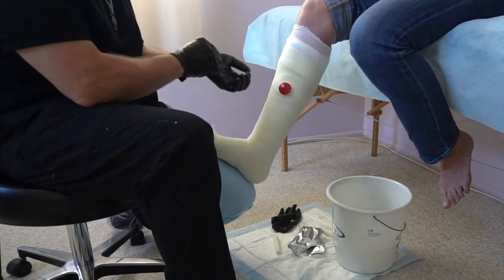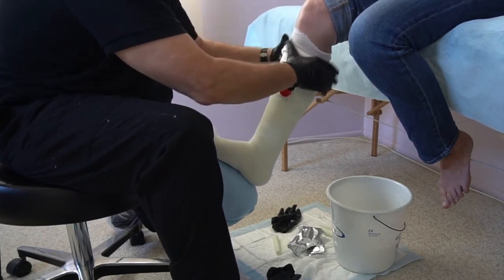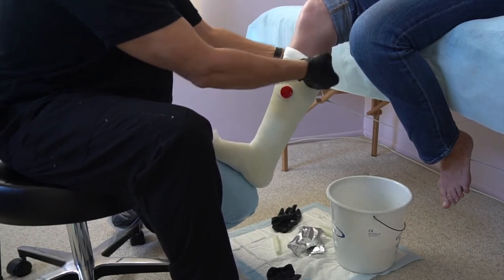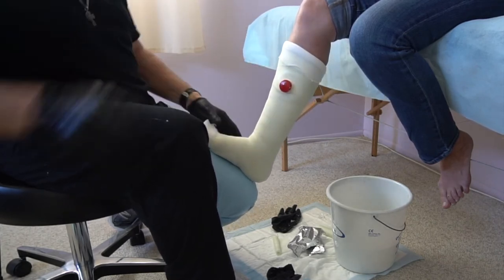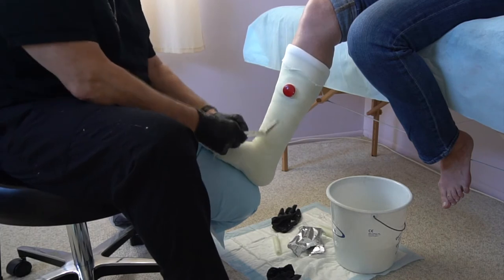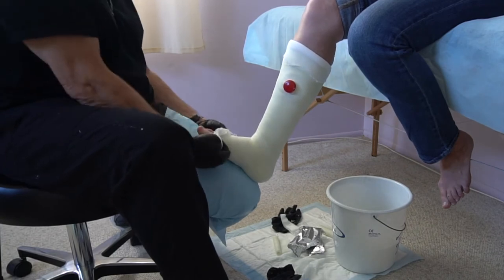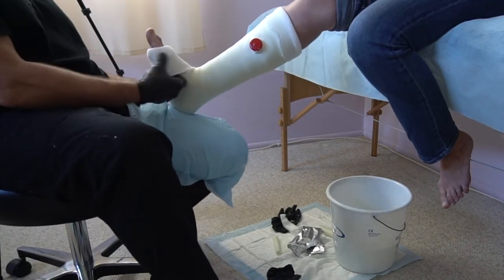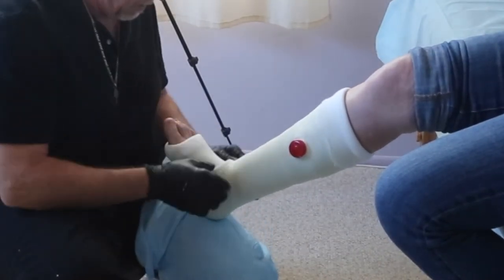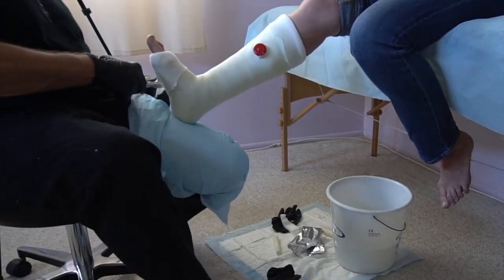Get rid of the first wet sticky set of gloves and fold that cotton over. If you need a little more, go ahead and add another layer of cotton. And we'll peel that back. Let's take a look at what we have here. You can get rid of this or just fold it back. And you see — metatarsal heads are all cleared, and all five toes are exposed for keeping an eye on their size, color, and signs of swelling. Get rid of the excess.